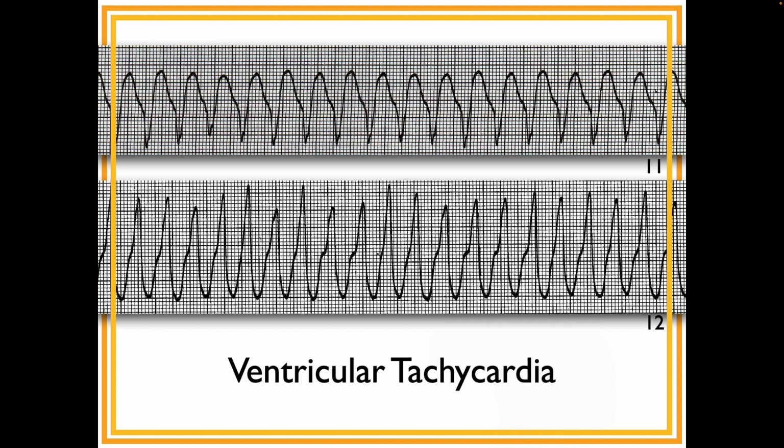Here it's exactly the opposite. I guess the QRS begins about here, and it goes up, and the J point is somewhere on here, maybe that little thing there could be the J point, and it's an inverted T. So the pointy part is usually associated with the QRS, and this rounded part is the T? Yes. Sometimes it's easy to tell and other times not.